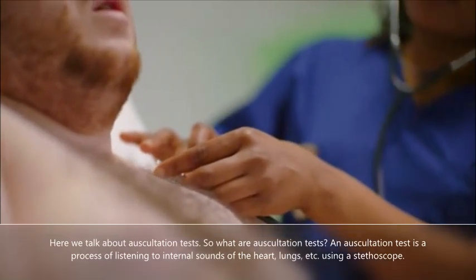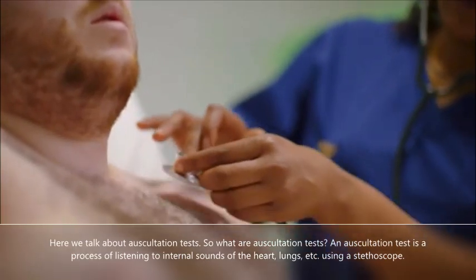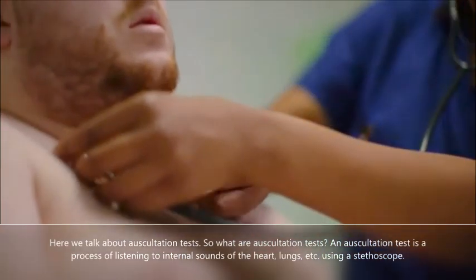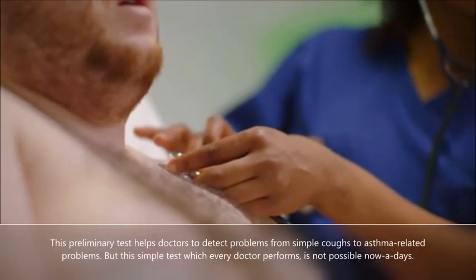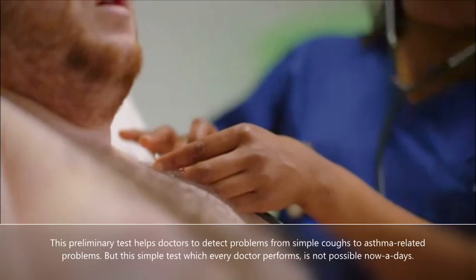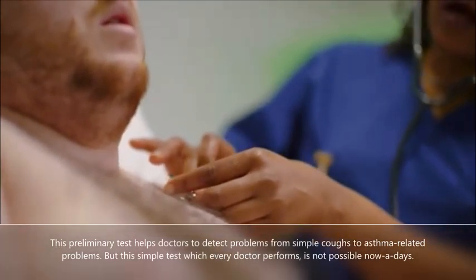An auscultation test is a process of listening to internal sounds of the heart, lungs, etc. using a stethoscope. This preliminary test helps doctors to detect problems from simple coughs to asthma-related problems. But this simple test, which every doctor performs, is not possible nowadays.